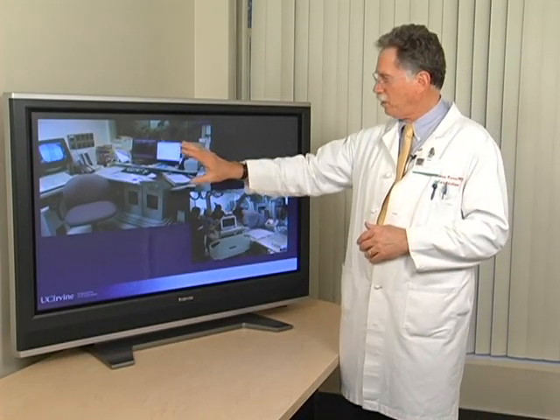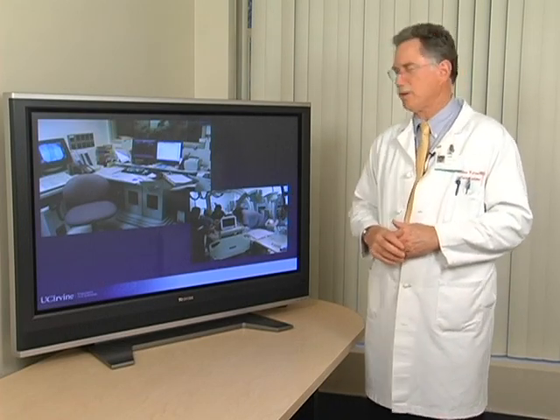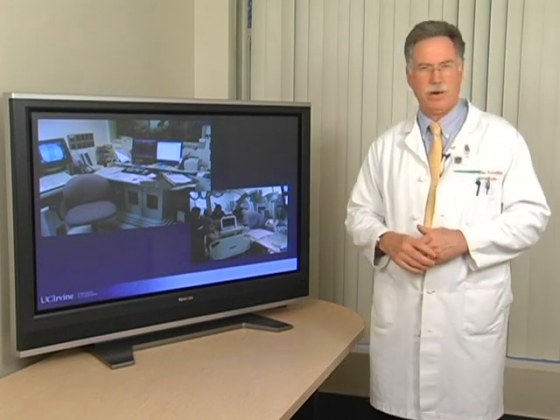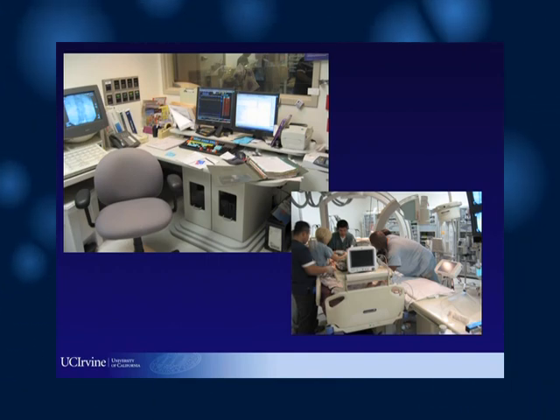This is a typical cath lab room with the recording station here, where our monitoring person is looking into the room to acquire the signals that we're generating at the table side. A team effort is required, and that's why it's worthwhile talking about this before we even engage in discussing the tracings that we will be using.